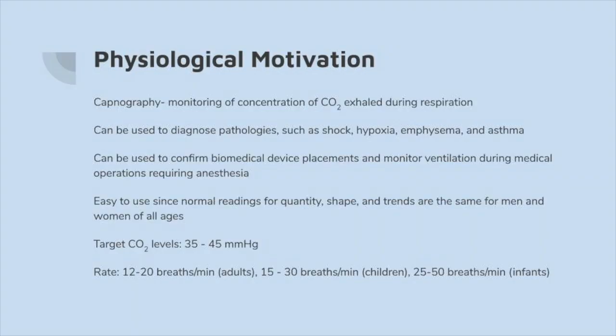Capnography is the monitoring of end-tidal carbon dioxide levels, or EtCO2. A capnogram measures EtCO2 levels as the partial pressure of CO2 in an expiration in units of millimeters of mercury. Normal CO2 levels in an expiration range from 35 to 45 millimeters of mercury.